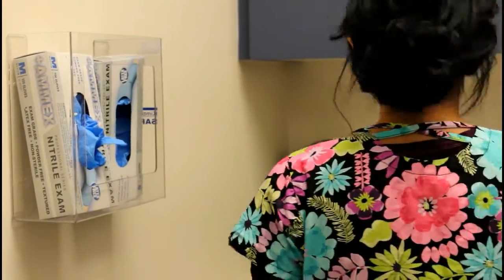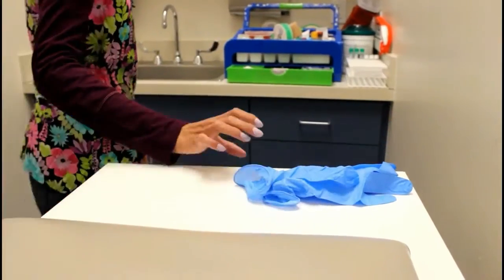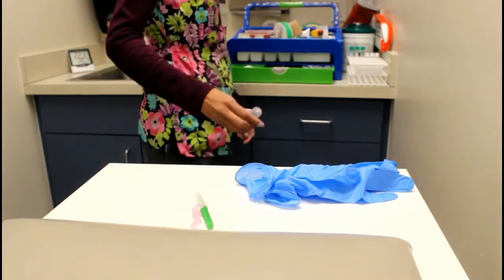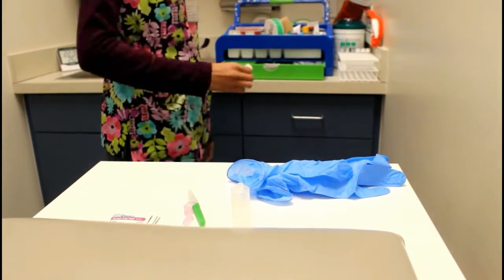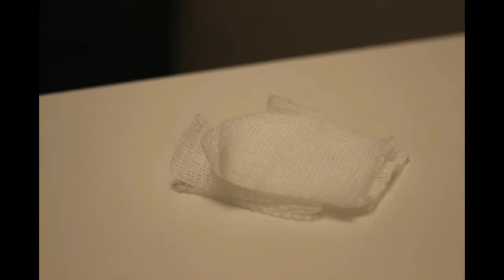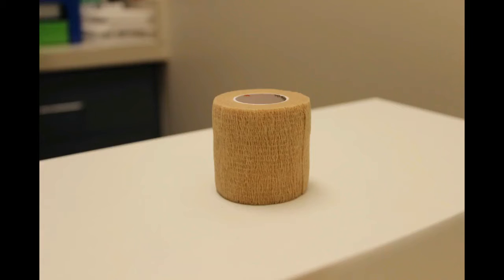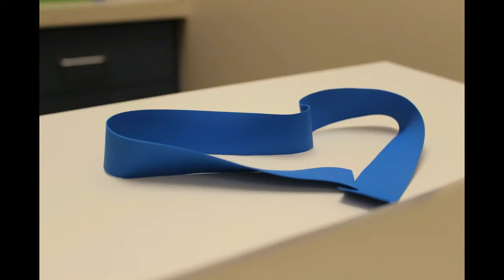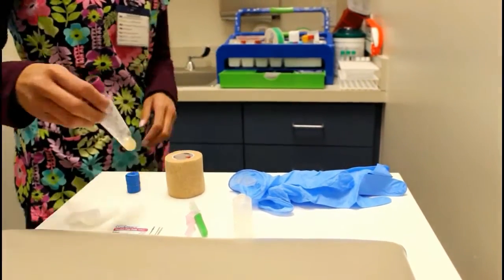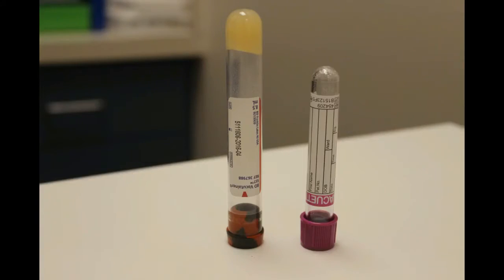Next, gather required materials. This includes gloves for both hands, a needle, a hub to hold the tube in place, alcohol pads to cleanse the site of puncture, gauze to absorb excess blood, Coban to apply pressure to the site, a tourniquet to accumulate the blood in the veins, making them accessible, vacutainers to collect the blood sample.